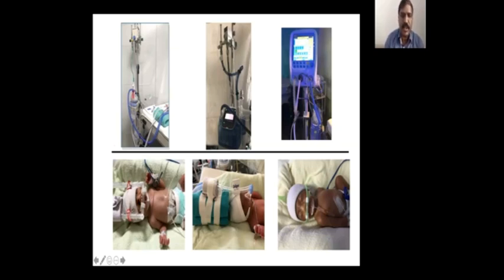And the interfaces, you can choose any one of the 3 interfaces, either Hudson prongs or Drager mask or Ram's cannula CPAP. So one of the 3 choices you have, and whatever choice you are using, continue to use it long so that your experience improves and your nasal injuries come down. So you have choices of CPAP machine and you have choice of interface. But our choice is, yes, we'll start CPAP for this baby.